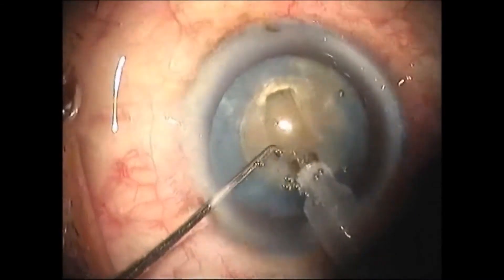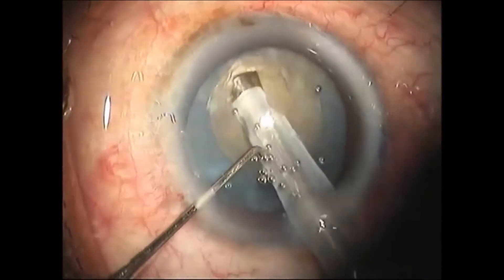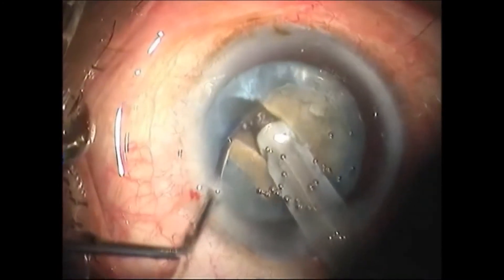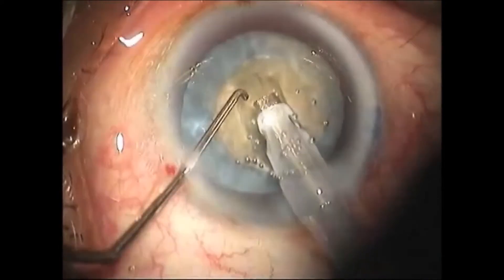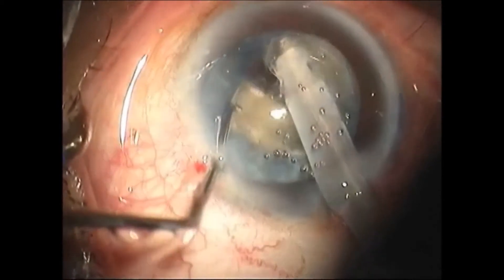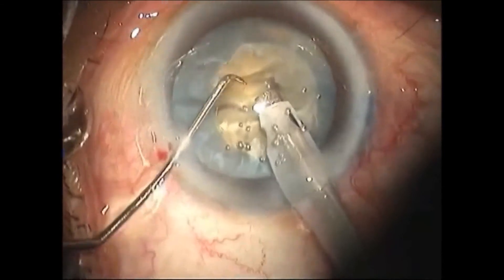In a case of a soft mature cataract with good zonular support and parameters set right, the surgeon performs a stop-and-chop technique. After trenching two-thirds of the depth, cracking is initiated. We need not wait to see the red glow, but make sure that the cracking happens completely.